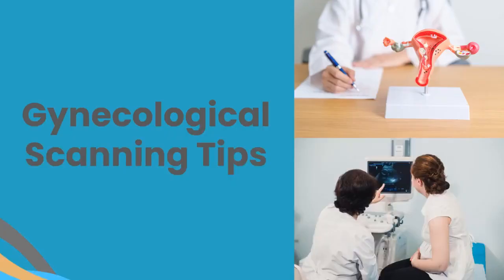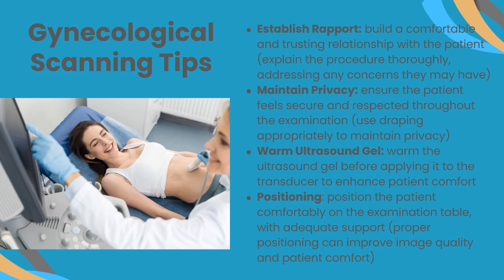Some ultrasound gynecological scanning tips. Establish a rapport with your patients, make them comfortable, explain everything you're doing throughout the process, and address any concerns that they may have. Maintain privacy, ensure the patient feels secure and respected. Use draping appropriately to maintain privacy. Warm the ultrasound gel. Sometimes it adds a nice touch and helps the patient be more comfortable.